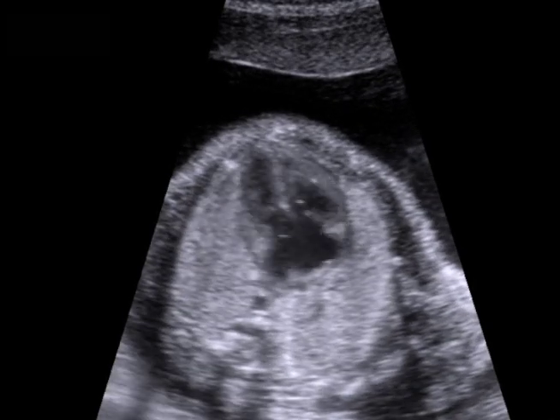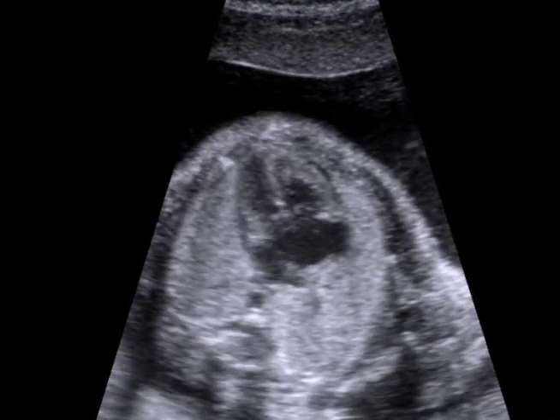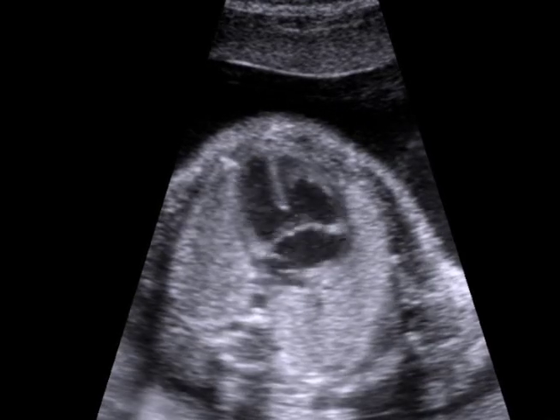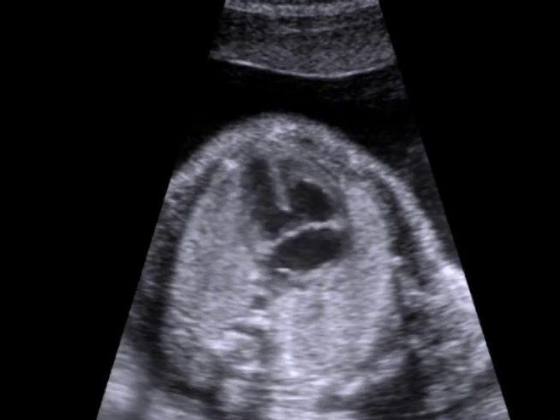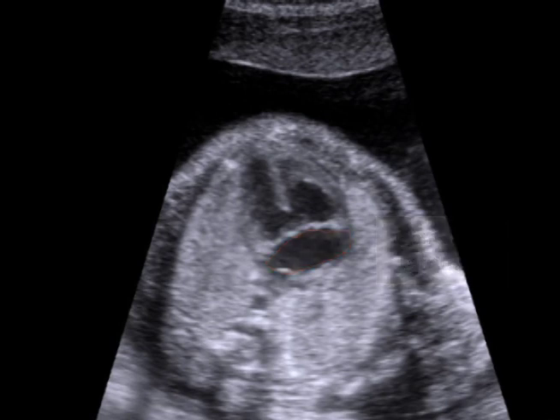This cine clip is from an affected fetus. Movement of the valves and septal defects highlight the AV canal defect. The septum primum defect results in a common atrium. During ventricular systole, the lateral atrioventricular valve leaflets come together in the midline.